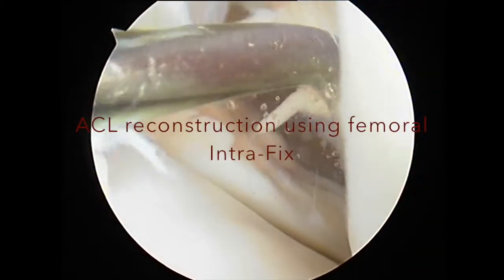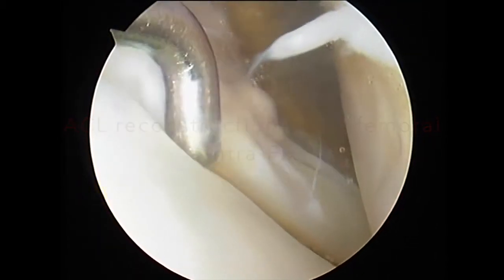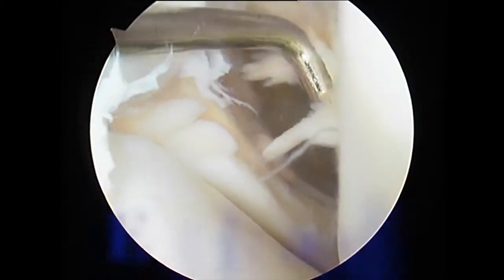I am presenting in this video clip my current technique for anterior cruciate ligament reconstruction using the femoral intrafix on the femoral side.